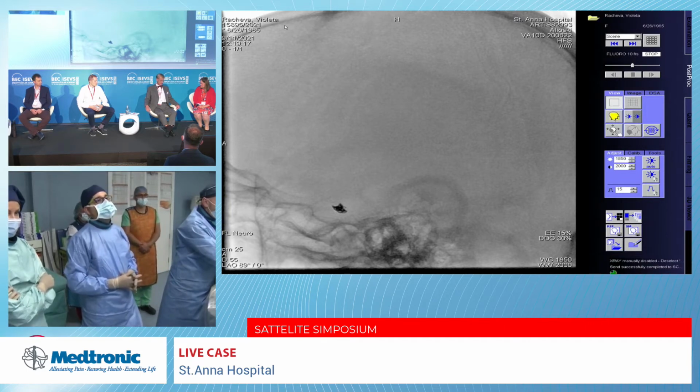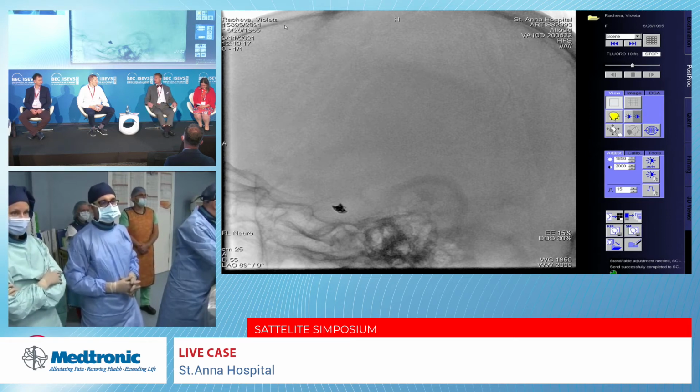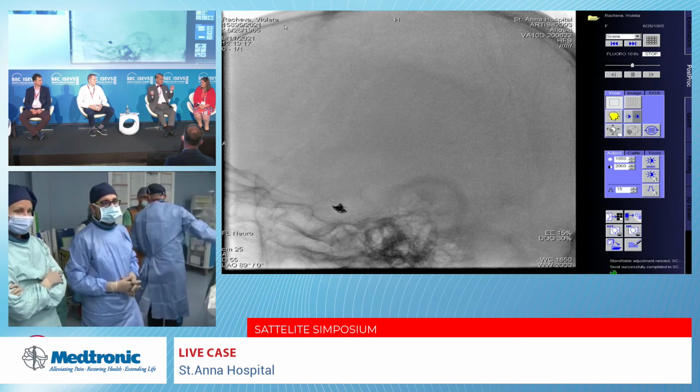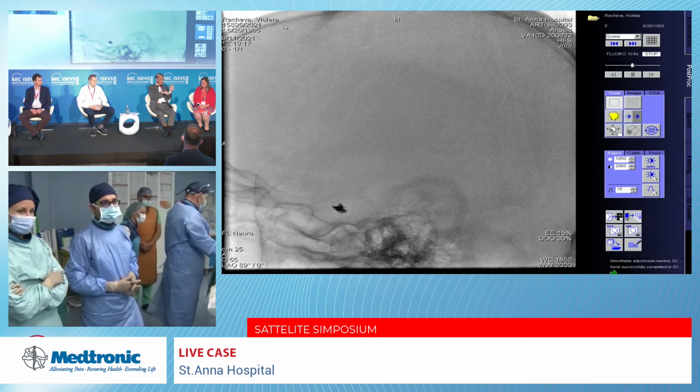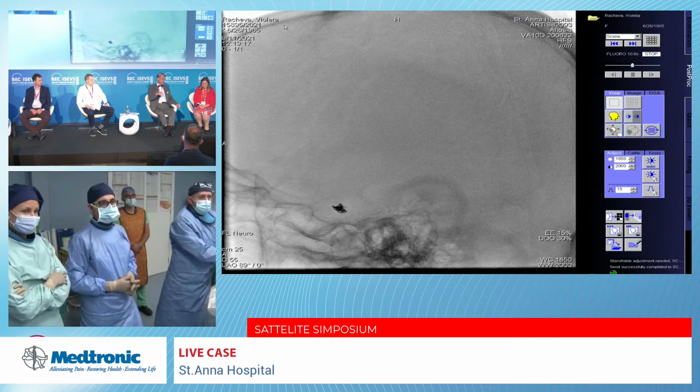Yes. But I also want to add perhaps something on aneurysm coiling. I expect that not all of you are doing these procedures. So when you have a very narrow neck, you can coil very easily and fill it very well. When you have a large neck, the coils have a good chance to drop out. And then you also have different techniques, which were shortly mentioned.